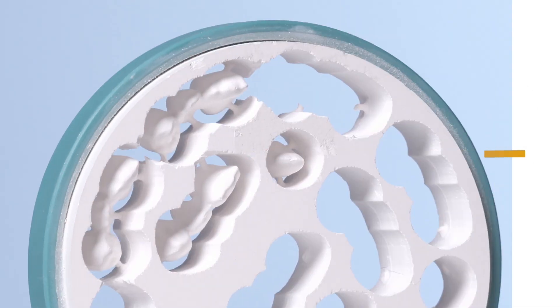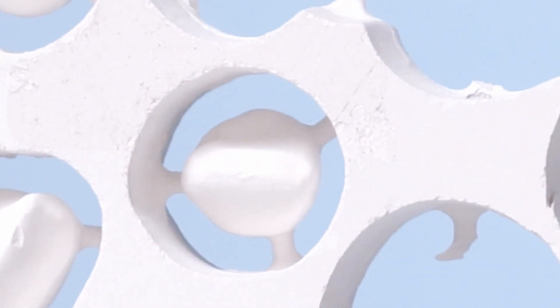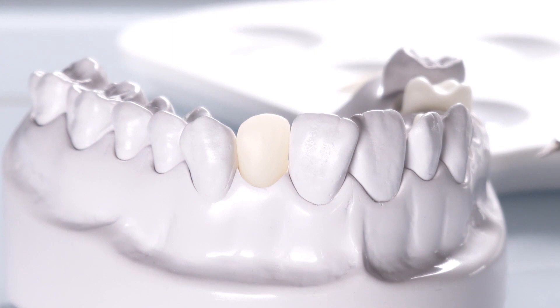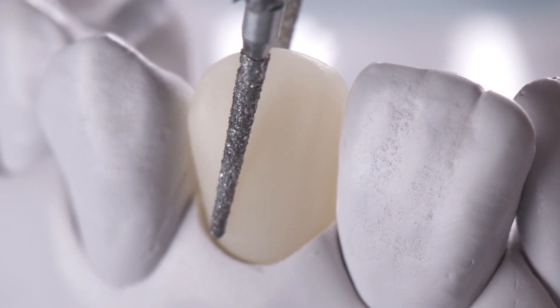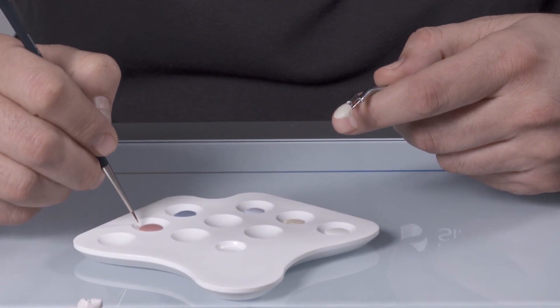The extra-translucent Circon XT Zirconia material provides a high level of aesthetics with monolithic restorations. All that is required is a final customization with universal stains and glaze.